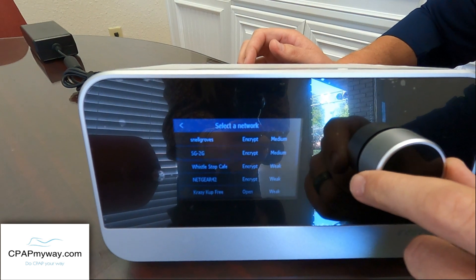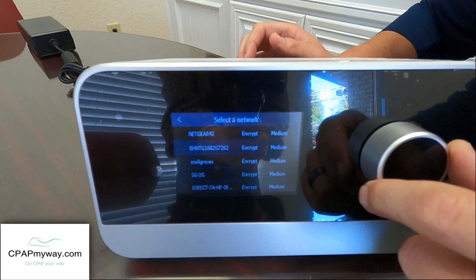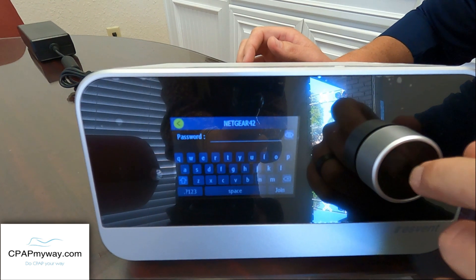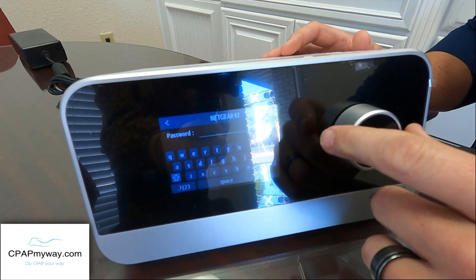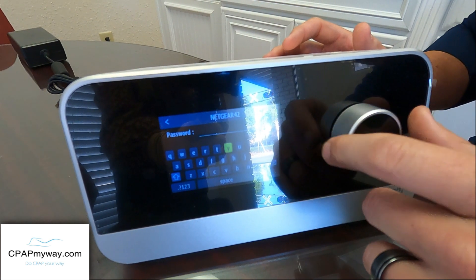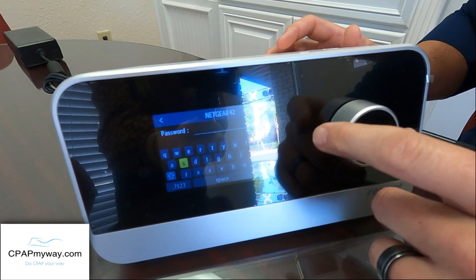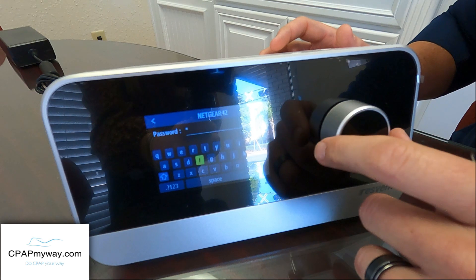Then you should see a listing of your different Wi-Fi networks. We happen to be on the Netgear. And this is where you'll enter your password — you scroll and press Select. I have to fast forward so you guys don't come over here and use my Wi-Fi for free.